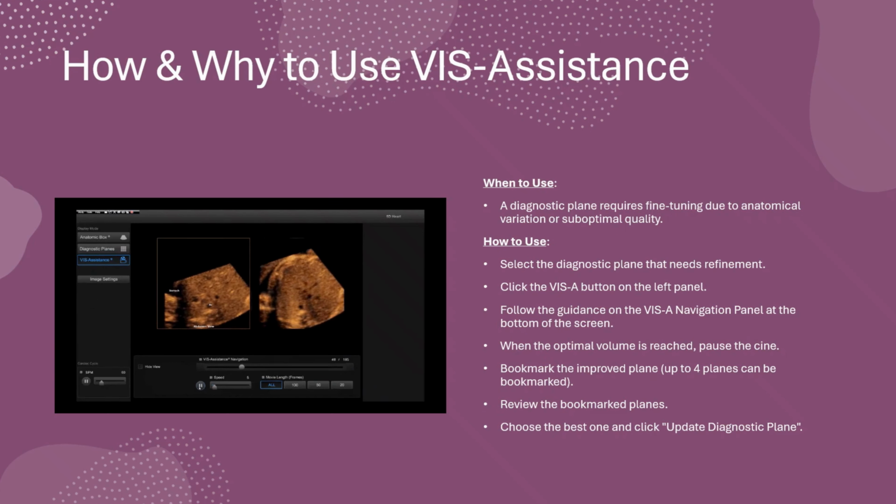First, select the diagnostic plane you want to improve. In this example, we will choose the stomach plane. Then click the VIS-Assistance button on the left-hand panel. You will see guidance pop up in the VIS navigation panel at the bottom of the screen. Just follow these prompts. Once you've reached an optimized volume, post cine, then bookmark the improved plane.